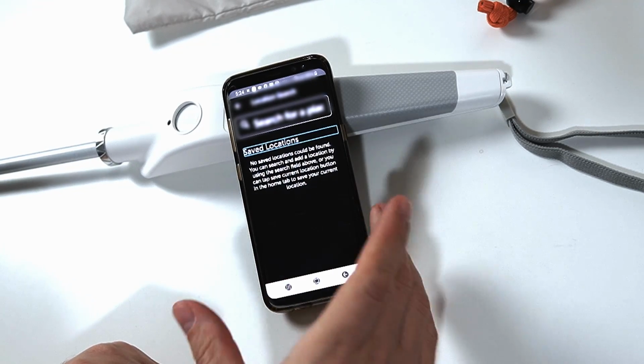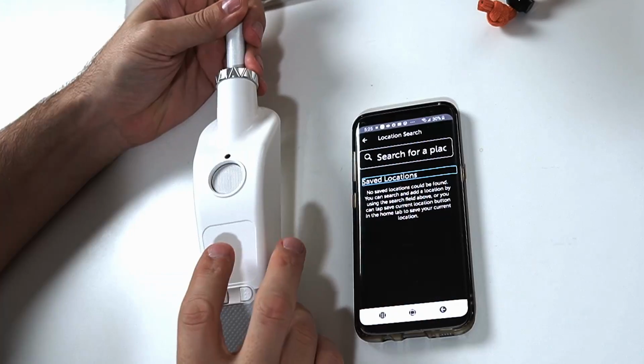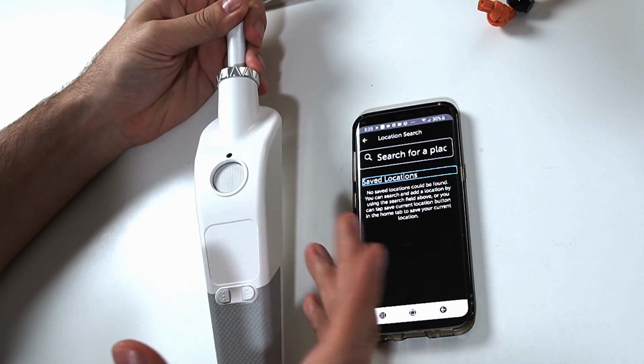So let's see what the WeWalk cane can do not using the app. I can double tap on the touchpad here to get into the menu.